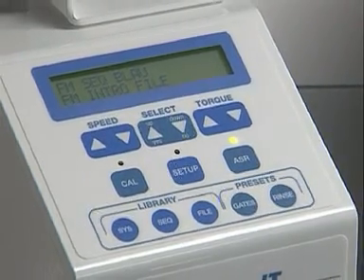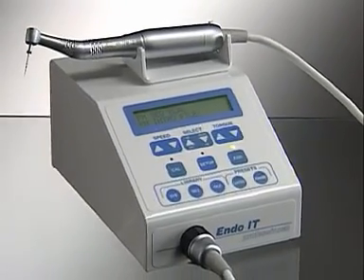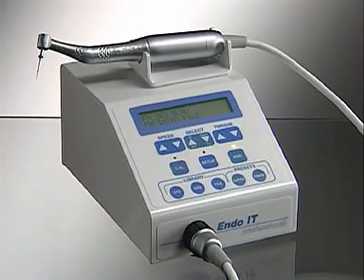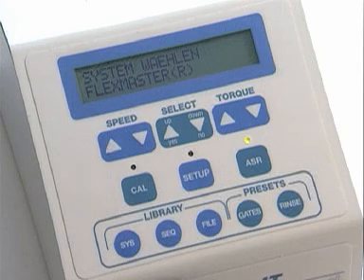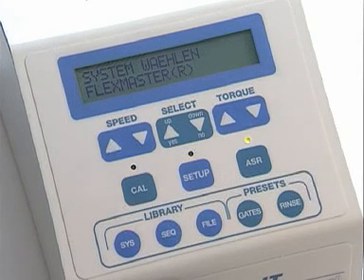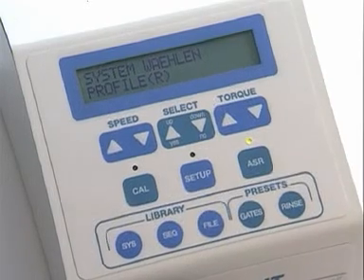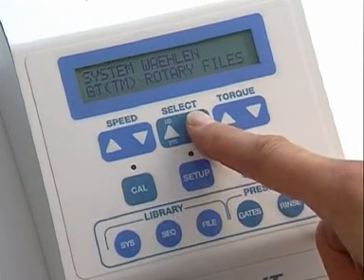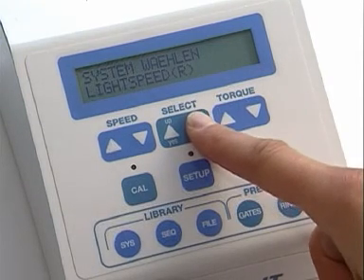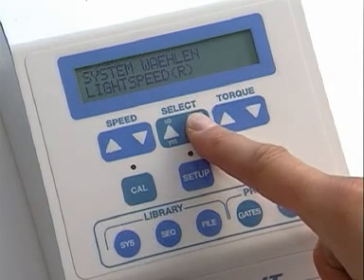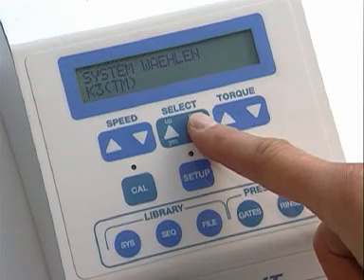Endo-IT Professional is a motor with pre-programmed torque and speed settings for each selected instrument. The pre-programmed settings are not only for the Flexmaster instruments, but for all major NITI file systems from other manufacturers. Program control ensures that every file is driven at a torque level which enables maximum dentin removal without overloading the instrument. This prevents file fracture.